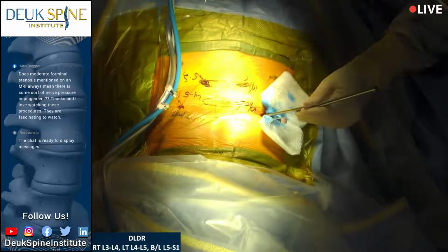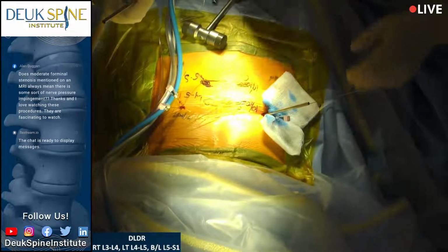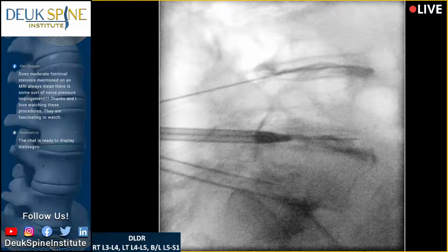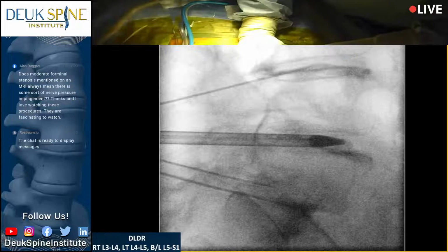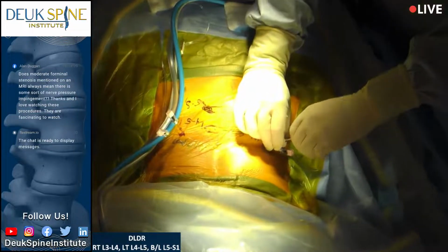Now I'm entering that disc. Yeah. So the guide wire's out because we're inside the disc. Big tear, shot. She's got a big tear in there. Okay, we got the dilator in. Next, I'm going to bring this tube over the dilator. And all of this equipment is FDA approved for this surgery, by the way. Once I get the tube in, we'll take the dilator out.